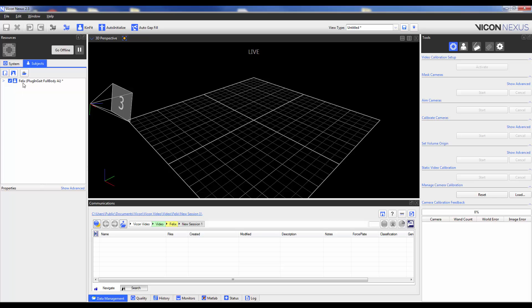When selected, I am going to see my subject name, the template, and an asterisk. The asterisk denotes that this subject has yet to be saved, or changes have been made to the template or the model, and those have yet to be saved.